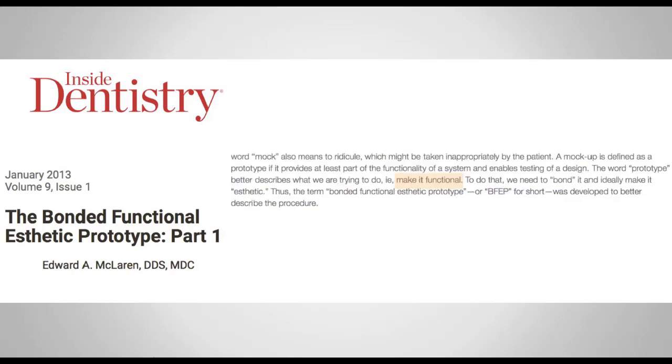The other aspect of it is that now we not only have this type of technique just to develop temporaries for porcelain veneers, but we can also measure their functionality.